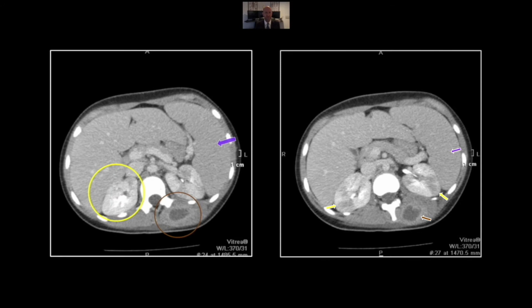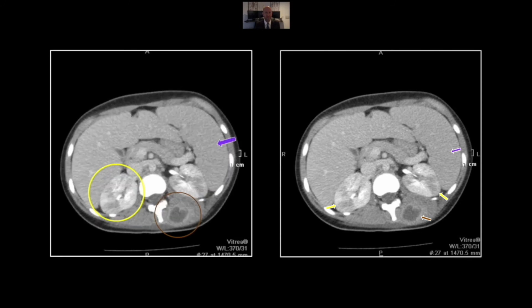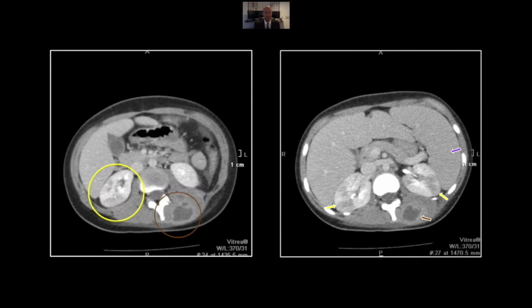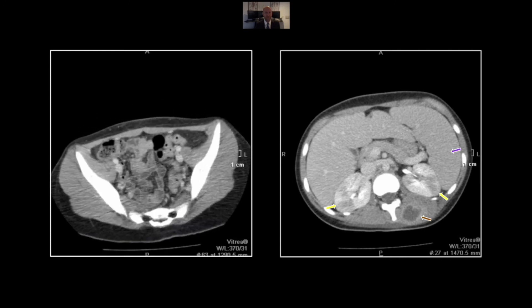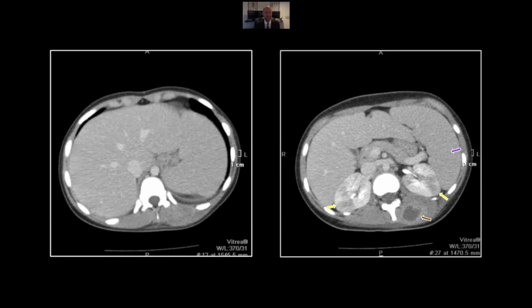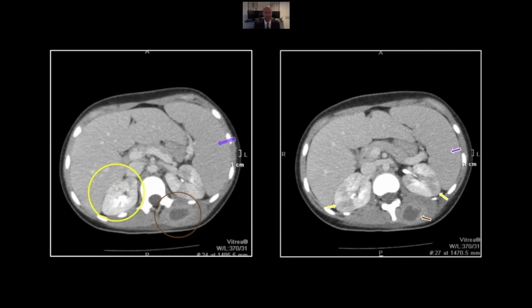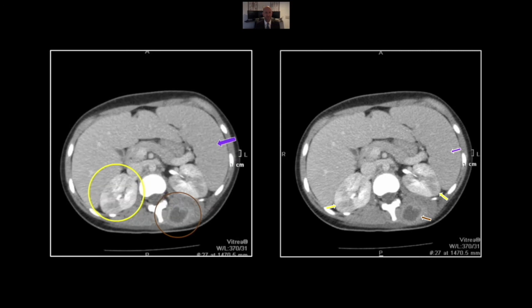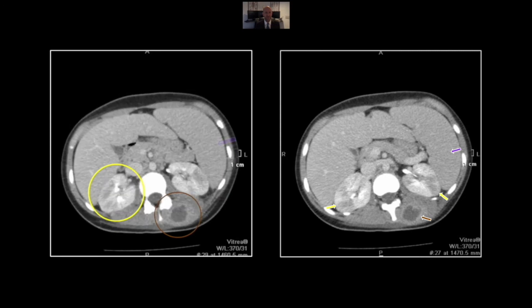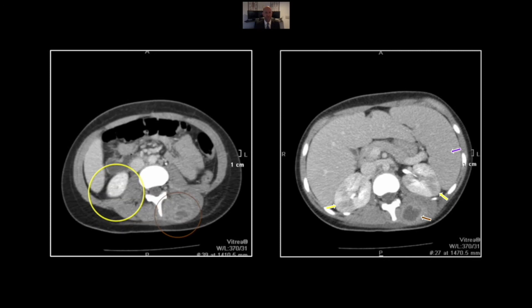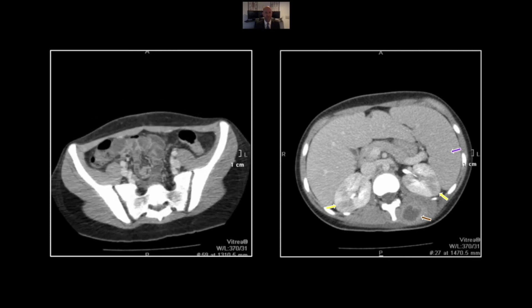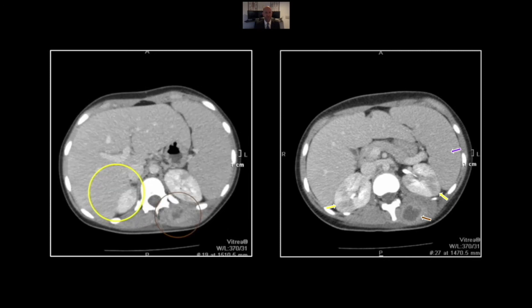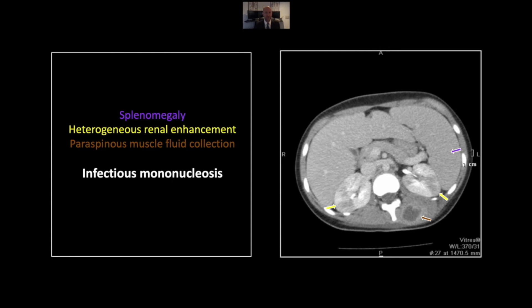Appreciate that splenomegaly. There is the nephritis and a soft tissue abscess in the paravertebral tissues there. Again, splenomegaly, nephritis, and a soft tissue abscess — that can be put all together, and the suspicion of infectious mononucleosis raised, I think, solely on the imaging findings.